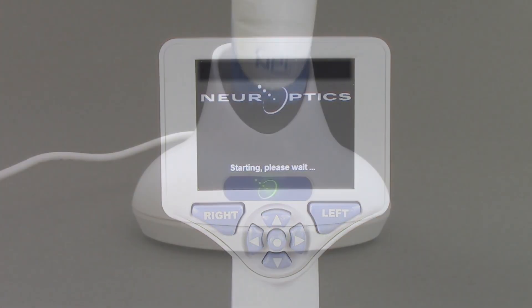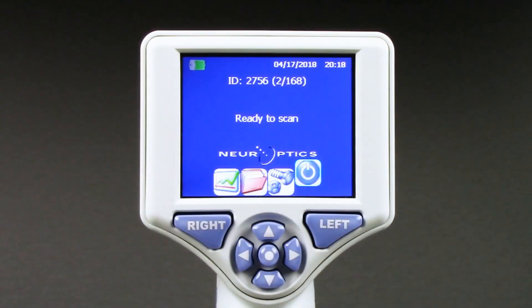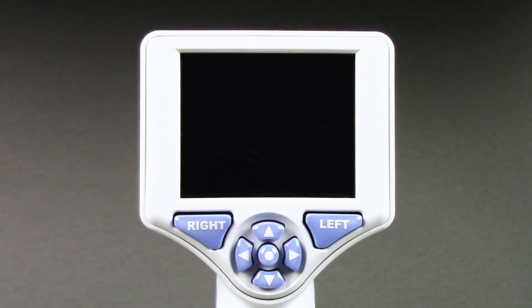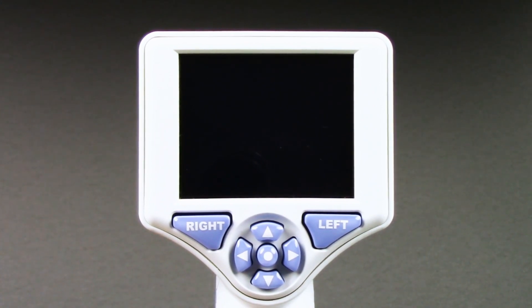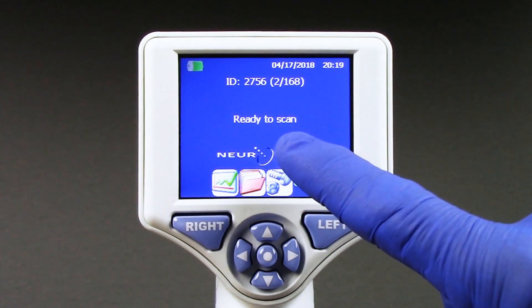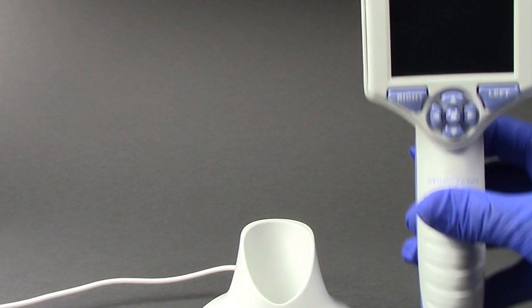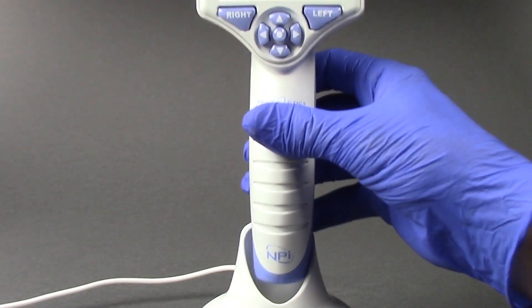When not in use, it is recommended the device remain powered on and seated in the NPI 200 charging station. If the NPI 200 is not in the charging station, to conserve battery life, the pupilometer will go into sleep mode after five minutes. To wake up the display, simply tap the touch screen, push any button, or return it to the charging station.